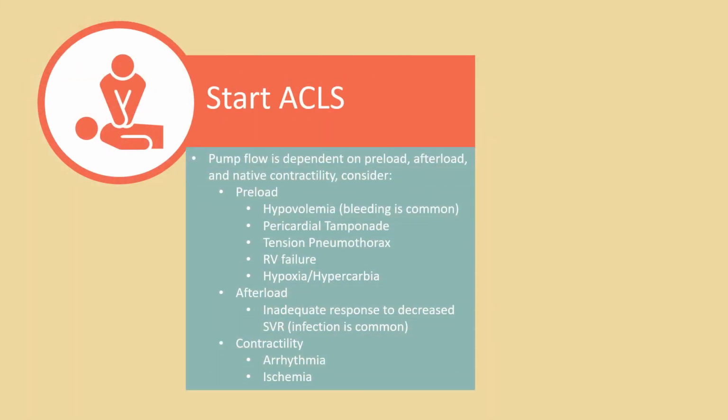So if you're not perfused or you question whether the patient's perfused, just start ACLS. Again, just do regular ACLS. It's okay to do chest compressions in this patient.